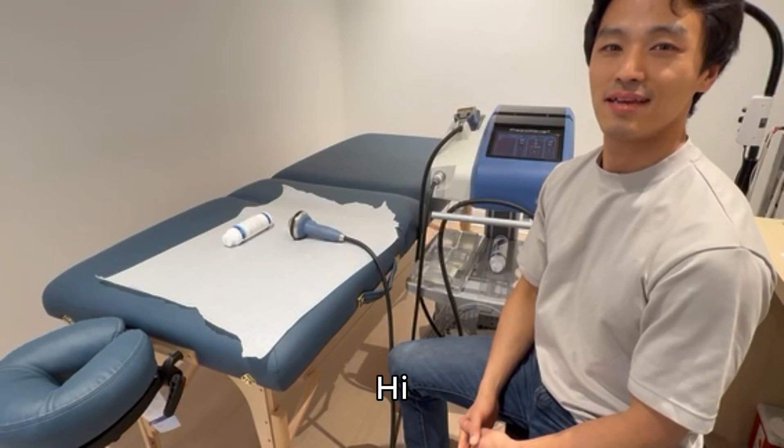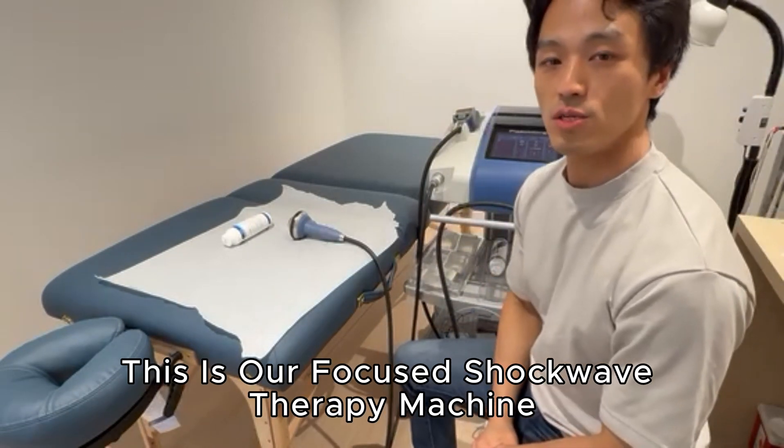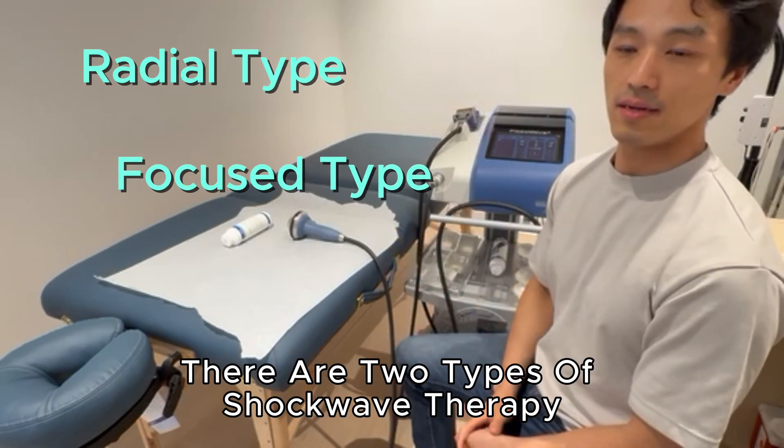What is the difference between radial shockwave therapy? Hi. What's this machine? This is a focused type shockwave therapy machine — ESWT. There are radial type and focused type, and we have both machines.